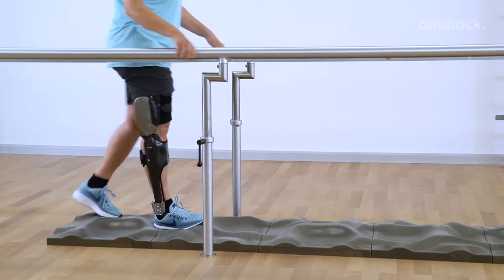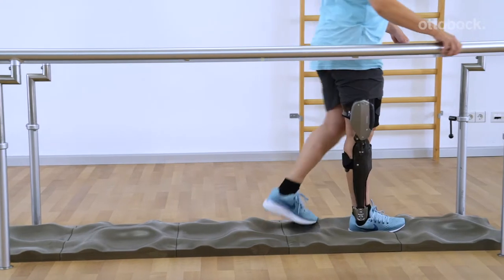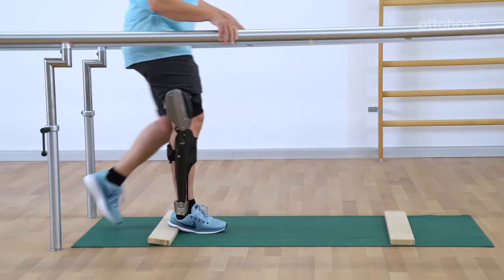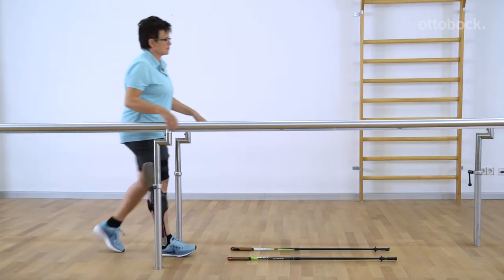After practicing walking under straightforward conditions, the level of difficulty is now increased with uneven surfaces, small obstacles, or by limiting the gate width.